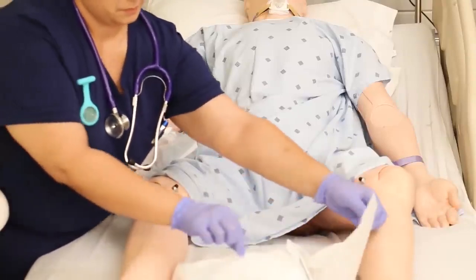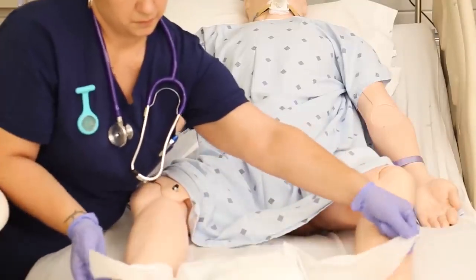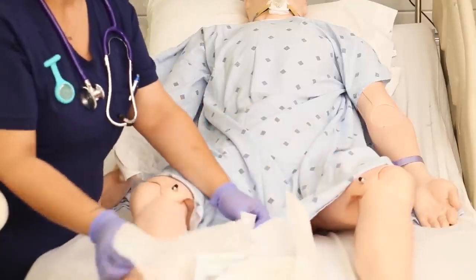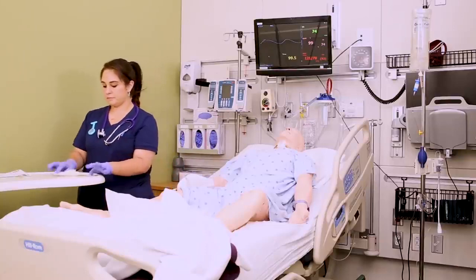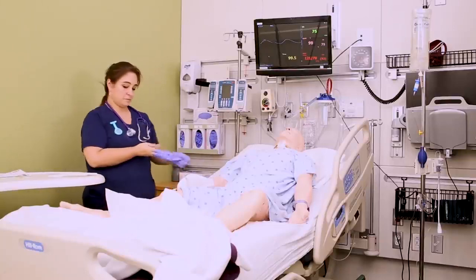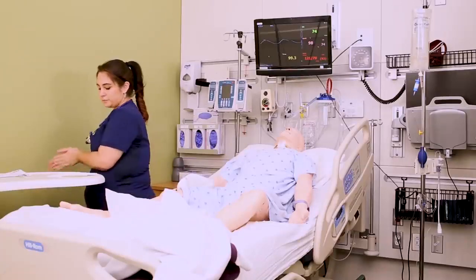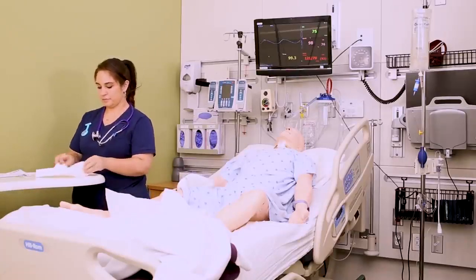Open the sterile kit on the bedside table, opening the kit away from you. Then pick up the kit from the bottom and place it between the patient's legs, reminding them not to move their legs or touch the kit. Once you have it open, carefully grasp the sterile gloves from inside the kit and apply them without turning your back on the sterile kit.